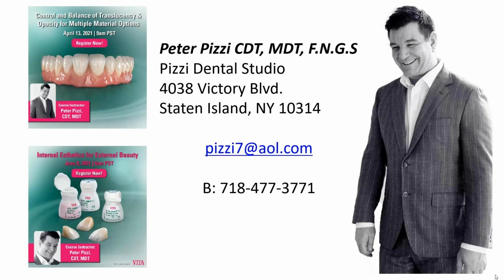I've said it 1,000 times. So the ultimate restoration is what's best for that particular patient at that particular time in that particular space. And that might be a thimble metal coping at 0.2 of a millimeter with a ceramic margin. It might be a monolithic zirconia. It really depends on all the effects that I'm looking to achieve in that moment.